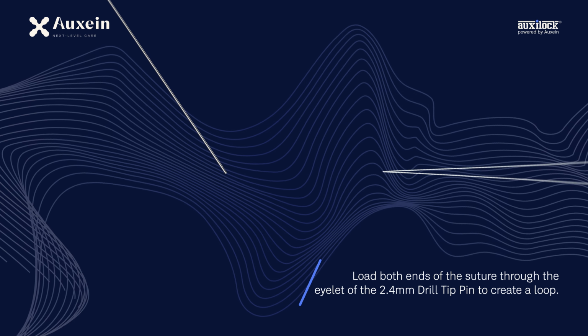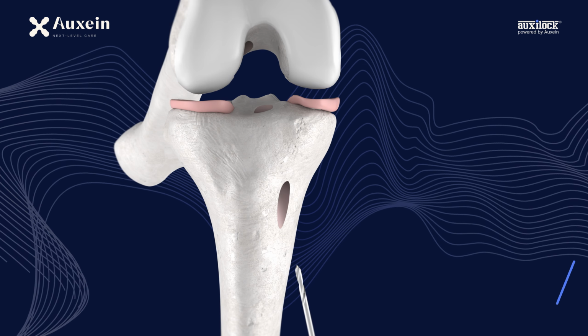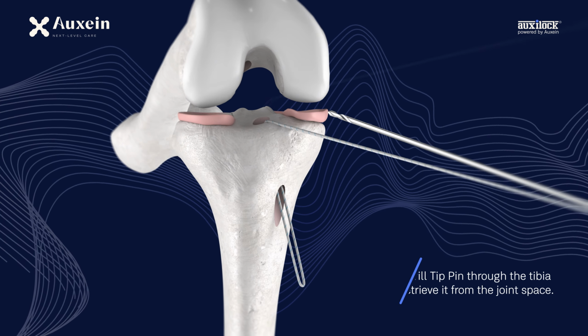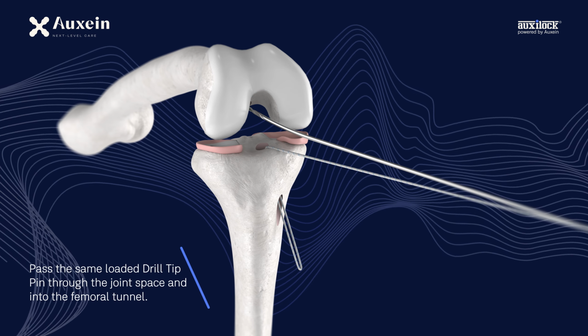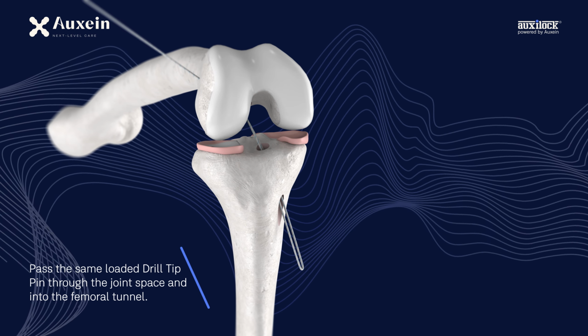Load both ends of the suture through the eyelet of the 2.4 mm drill tip pin to create a loop. Pass the drill tip pin through the tibia and retrieve it from the joint space. Pass the same loaded drill tip pin through the joint space and into the femoral tunnel.